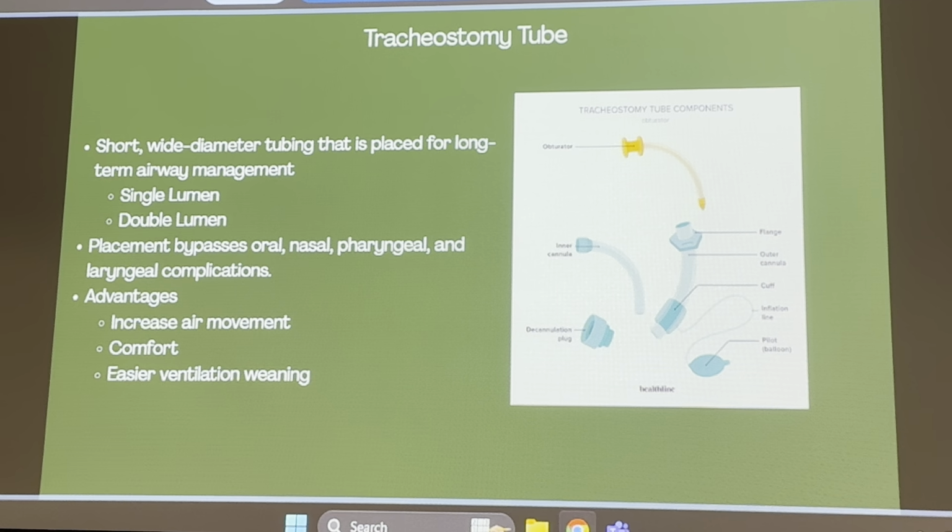I don't have a tracheostomy tube itself, but at this point, I feel like we've all done trach here at some point, probably all in the exact same patient. Y'all are all fans of tracheostomy tubes, I know. Well, let's talk about it just a touch.